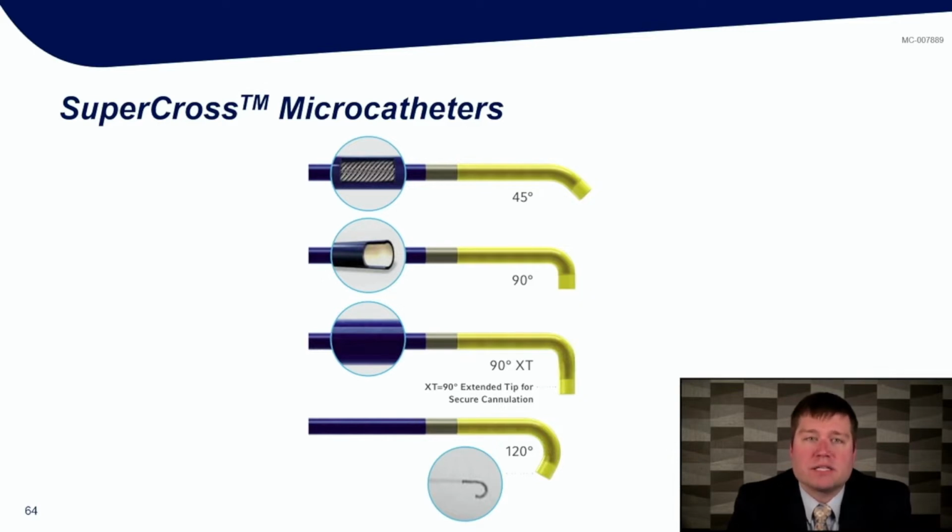But as the wire exits the 120-degree or the 90-degree microcatheter, the gram tip load of that wire is nearly infinite because you have the catheter supporting against the contralateral wall. So if you're not sure you're in the right spot and you push, especially a penetrative wire out, it will find a place to go and it may not be in a great spot. So making sure that you're using these catheters safely in order to achieve your goals is recommended, and then exchanging for a workhorse or supportive wire when you're done.